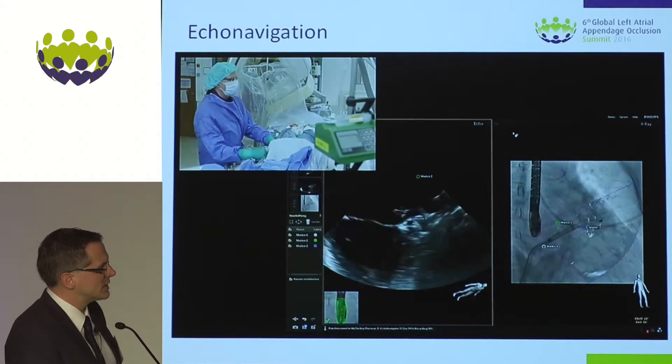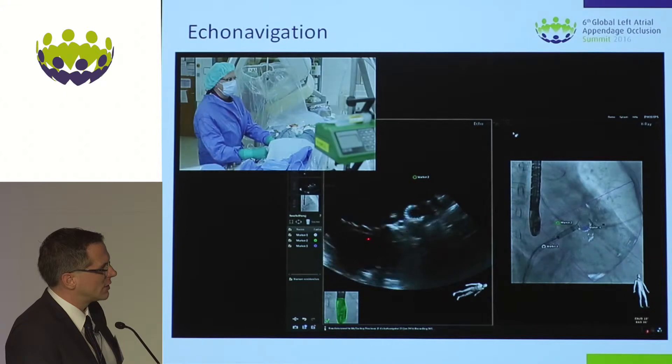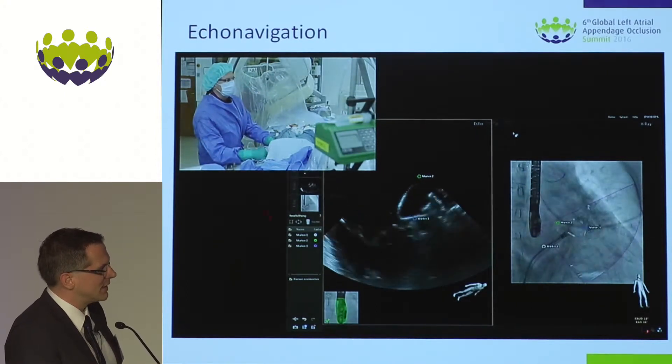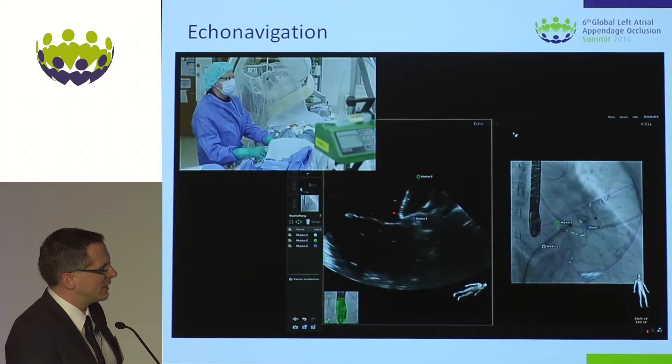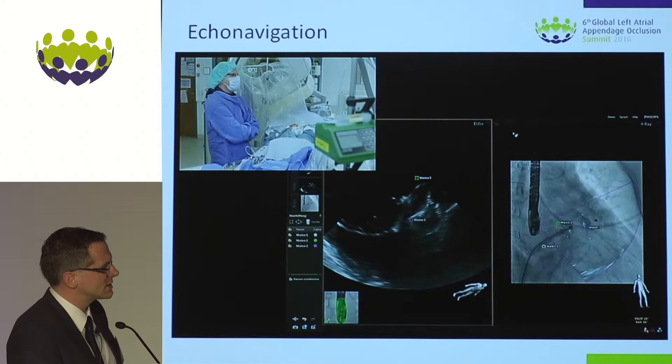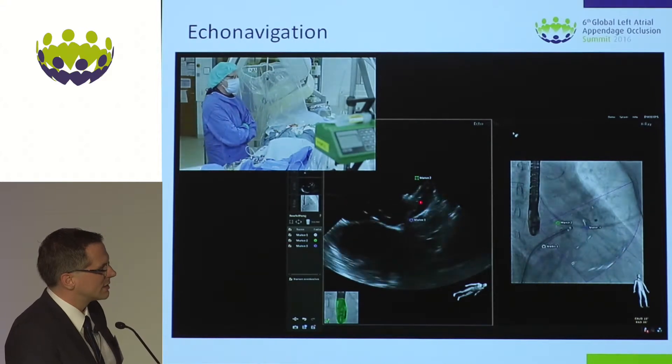Not that bad. As we see right now, the lobe is already within the left atrial appendage. Not that bad, but still a little bit perhaps too far outside. The disc is at the ostium.